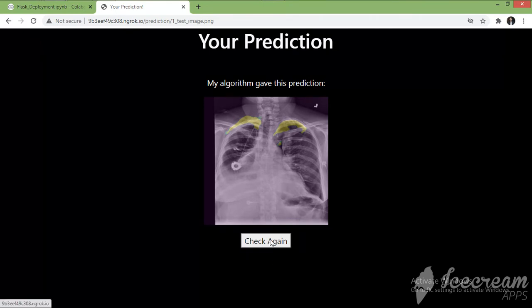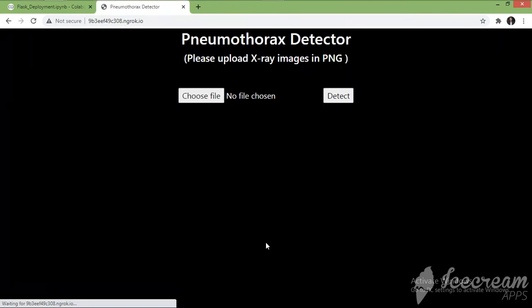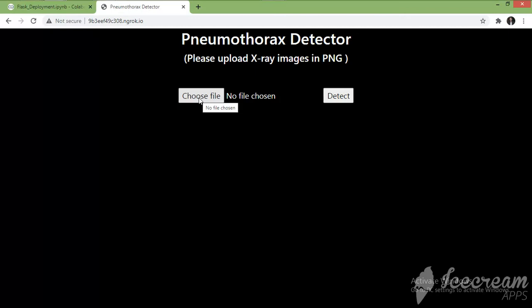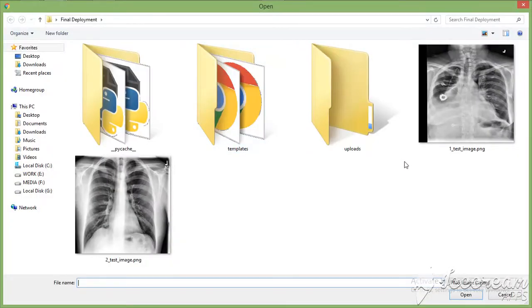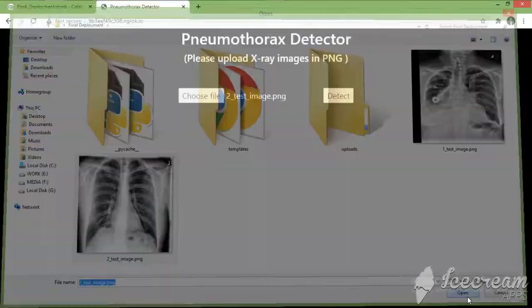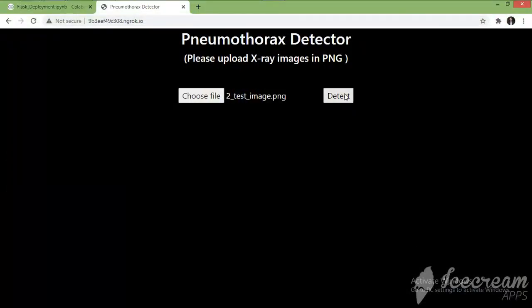If you want to check another image, just click on 'Check Again' and it will redirect us to the home page. Follow the same procedure — select another image and click on Detect.